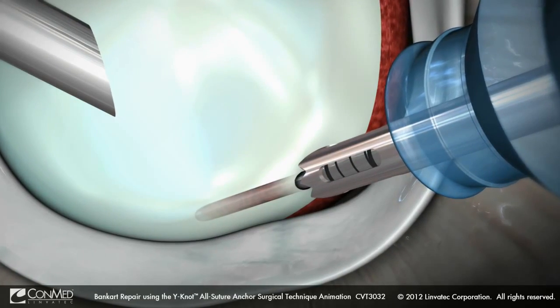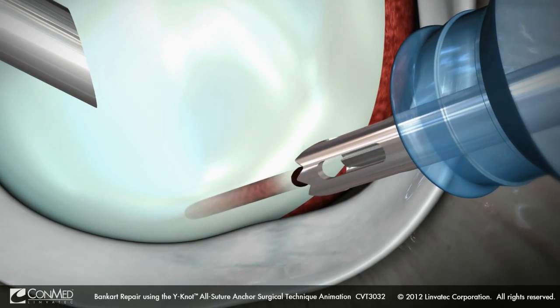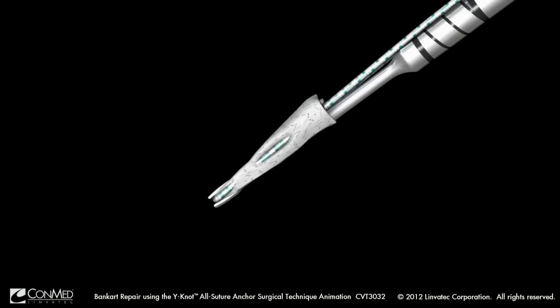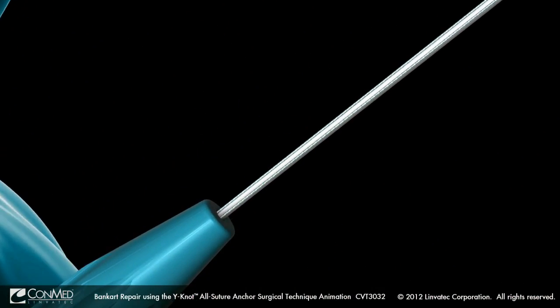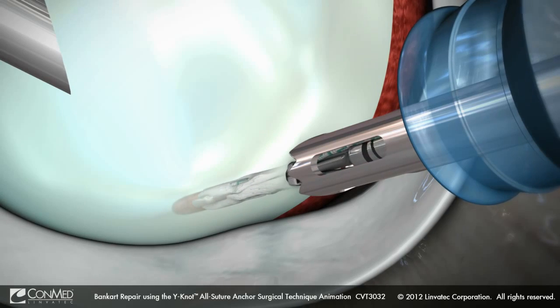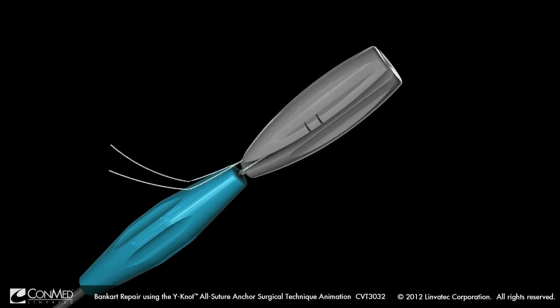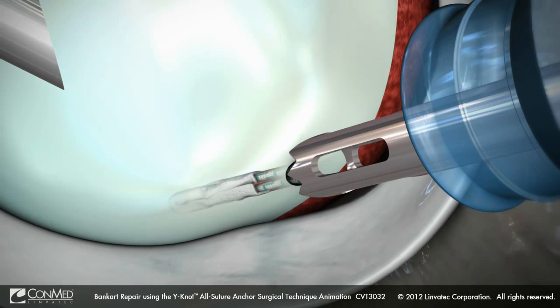While removing the drill bit through the drill guide, it's important to maintain position over the pilot hole with the guide. Insert the Y-Knot through the drill guide. Use a mallet to advance the Y-Knot until the proximal laser mark is flush with the proximal end of the drill guide. Release the suture from the driver cleats and remove the driver and drill guide from the joint.